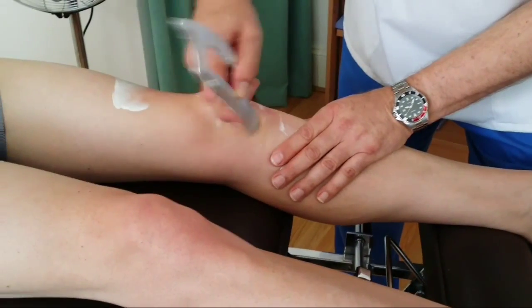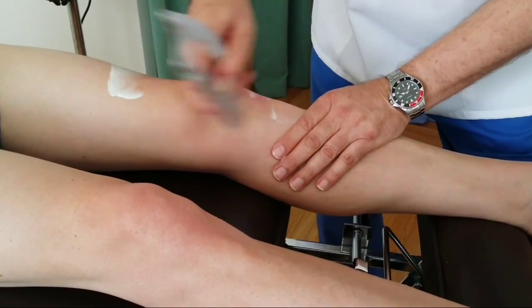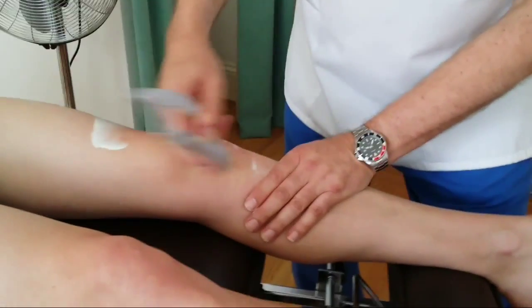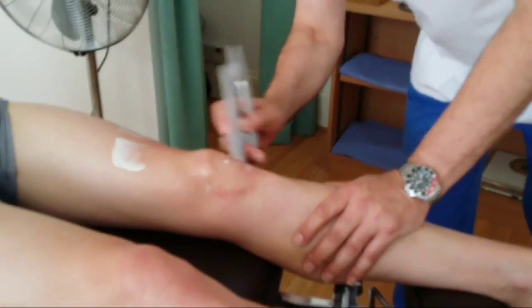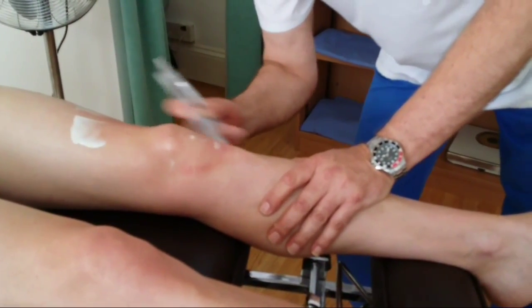For fine and more detailed work, a pen holder grip is used. The pen holder grip muscle memory we all have enables very precise strokes to be performed on areas where fine work and detail is required. The ergonomic features of our instrument, including the pen holder design, are design protected.